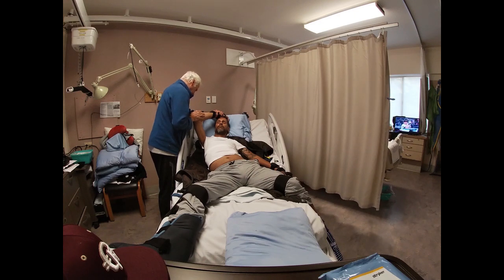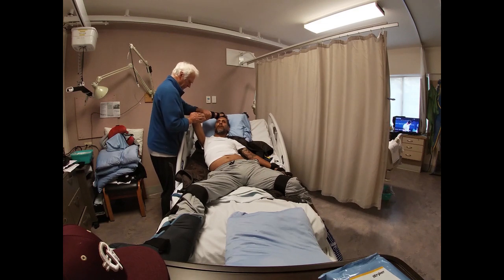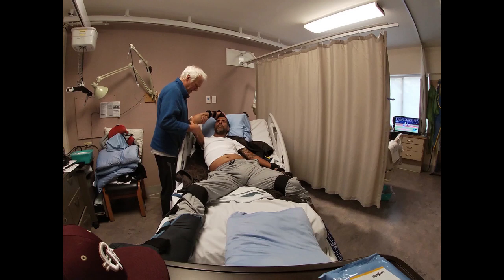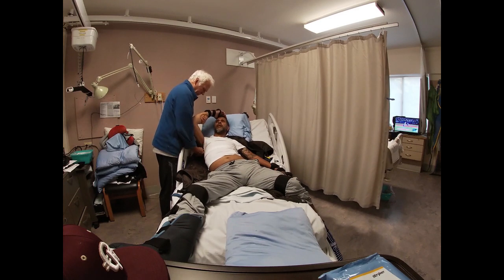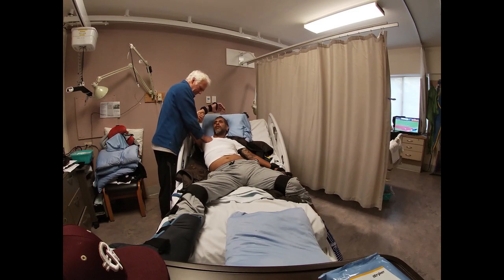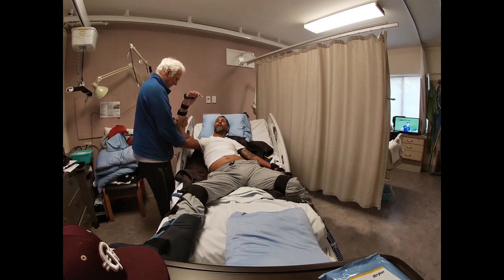So we're going to put the arm outside here, and we're going to work on the other arm too. How does that feel, Corey? Does it feel like it's really, really tight? Yes, it's strong, really tight within my chest and my tricep. On your tricep? Yeah. This part here? Yeah. And chest, in the front or in the back? Kind of more to the front. Back there is pretty good too. But here in the front? More like down the side of my rib cage almost.